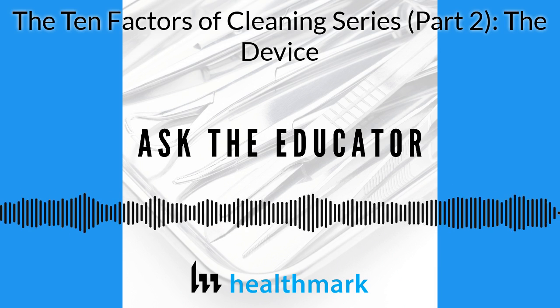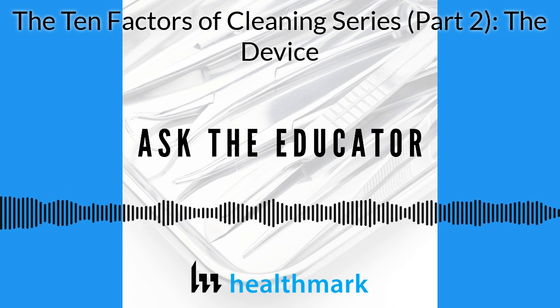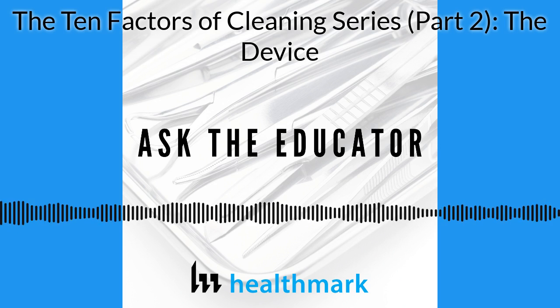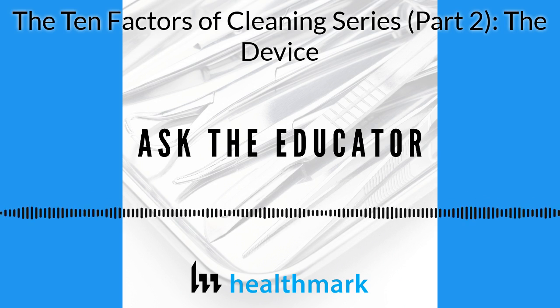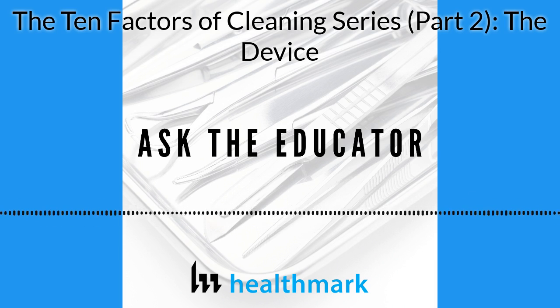Yeah, I like where you brought up this modular, because I'll focus for a second on MIS instruments. When they first came out, they just were non-ported and hard to clean. And then they evolved to having a little port. And now they're what you've sort of talked about. You got to take them apart, a shaft, the handles, and you need to know that. And you know what? This sort of gets back to the IFU, which gives you the direction.